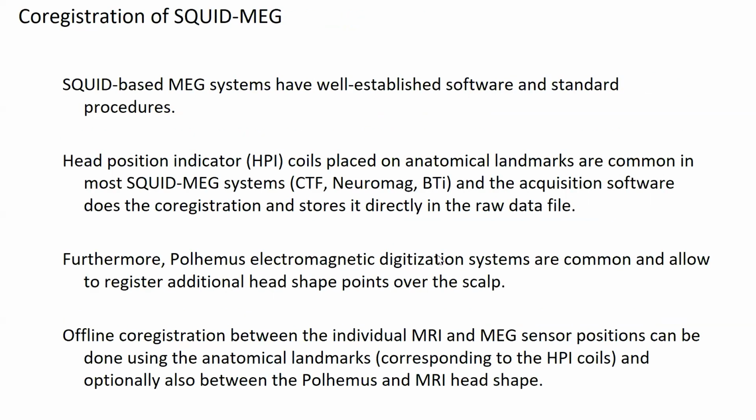Then moving on more to the data analysis, to co-registration, to source reconstruction. Squid-based MEG systems have all well-established software and standard procedures, and they all work with head position indicator coils, which are placed on anatomical landmarks, usually the ears and on the nose. And the acquisition software does the co-registration and stores the MEG sensors relative to the anatomical landmarks.